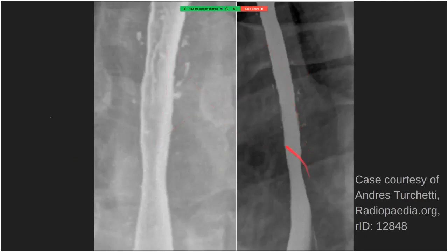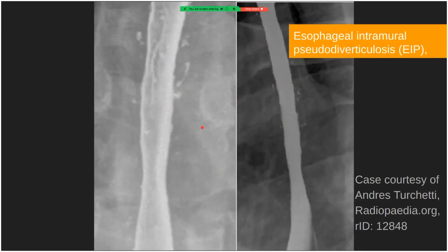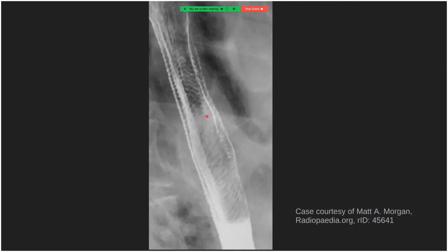This case shows double contrast esophagram on the left and single contrast on the right. There are small focal outpouchings of contrast on both sides of the esophageal lumen, some with a well-defined flask-shaped appearance. These are dilated mucus glands found in association with esophageal disease — the diagnosis is esophageal intramural pseudodiverticulosis. Candida can sometimes be cultured from these dilated glands, but the candida infection is considered a secondary infection, not the cause.